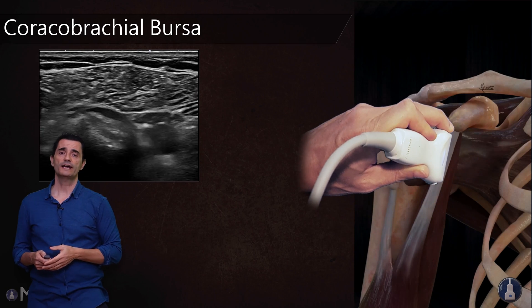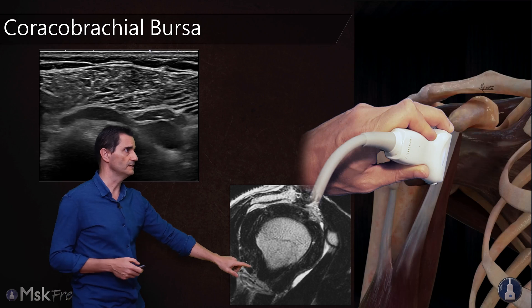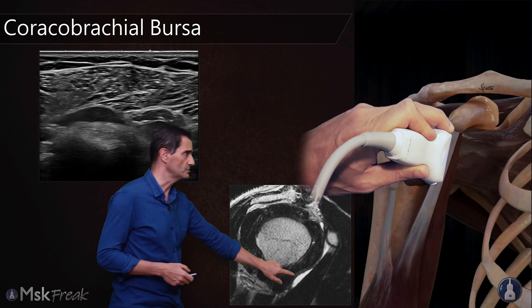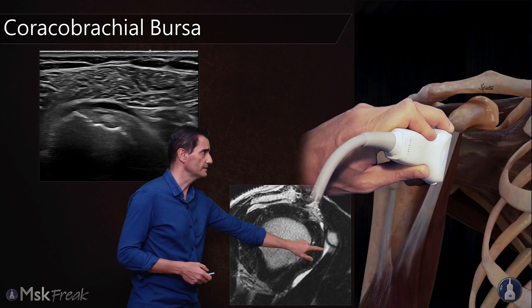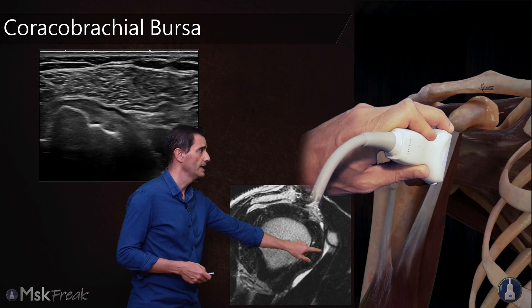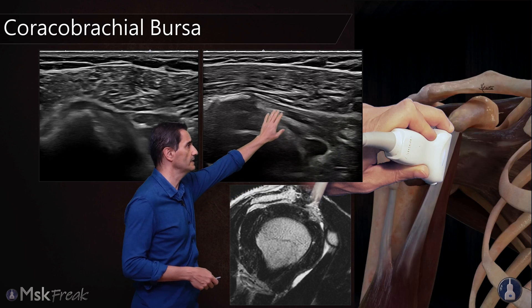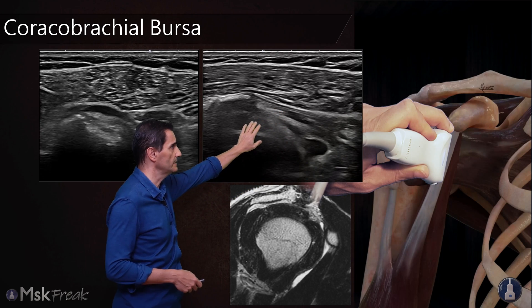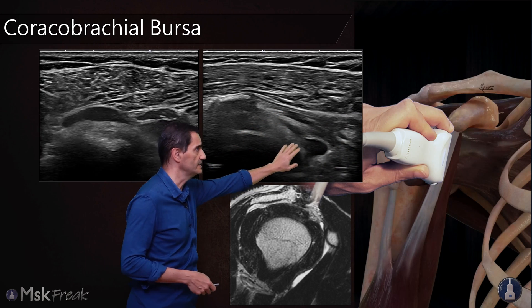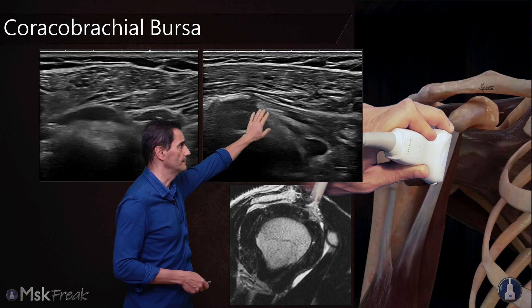In the long axis, you can see here the MRI — a very good image of the coracobrachial bursa. And this is the ultrasound. This is the coracobrachialis, this is the subscapularis, and you can see the bursa between them.